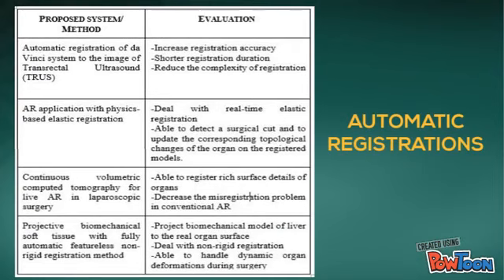Automatic registration reduces the complexity of registration. It deals with real-time and non-rigid registration. It can decrease the misregistration in conventional augmented reality. It is able to handle dynamic organ deformation.